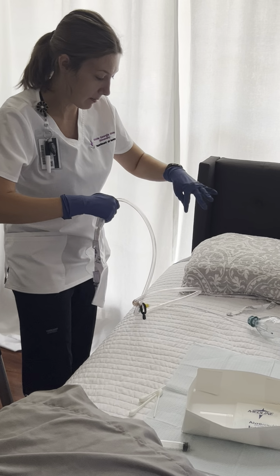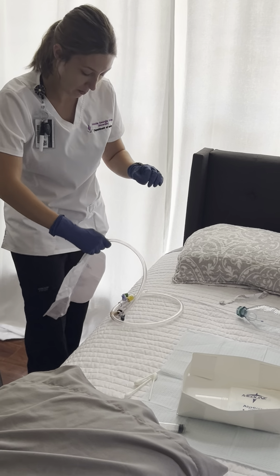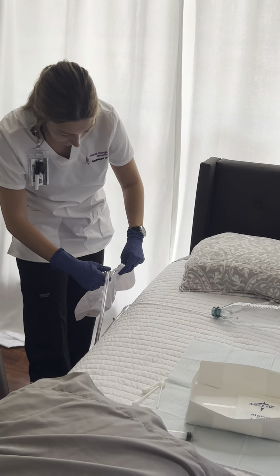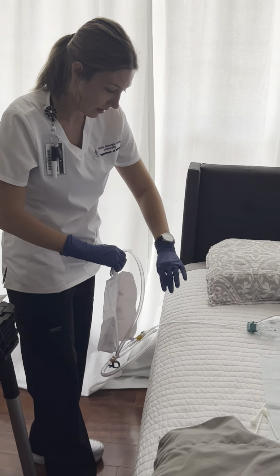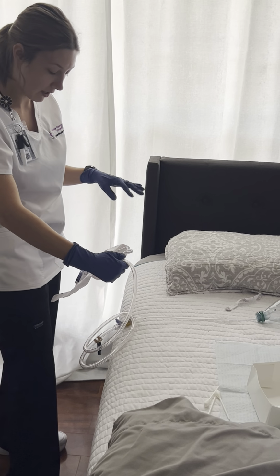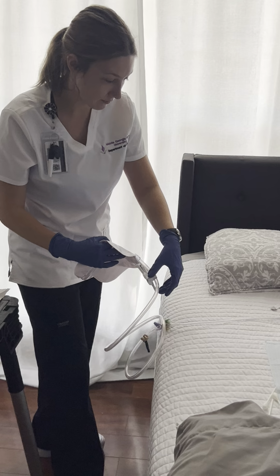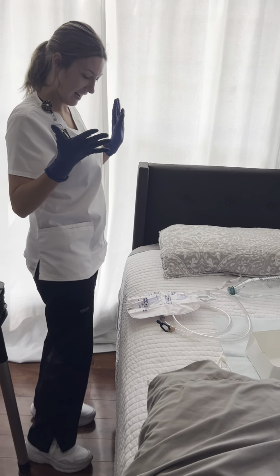And I'm going to grab a stat lock, secure that patient to the patient's leg, and I'm going to attach the bag to the side of the bed, a non-movable piece of the bed, and we're going to document the color, consistency, odor, and color of the urine. Just lay that there. We'll act like it's hanging on the side.